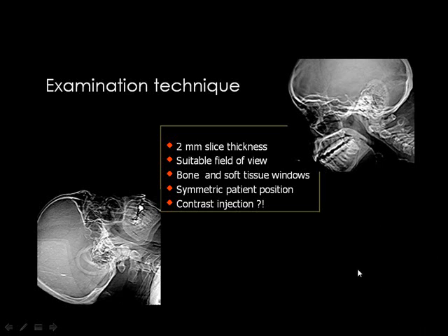First, in order to examine the Petrous bone by CT, we usually do both scans for the patient while he is in the supine position and in the prone position. In the supine position, we start by this, which is known as the scanogram, and this scanogram includes the area to be examined by CT, which is this region.